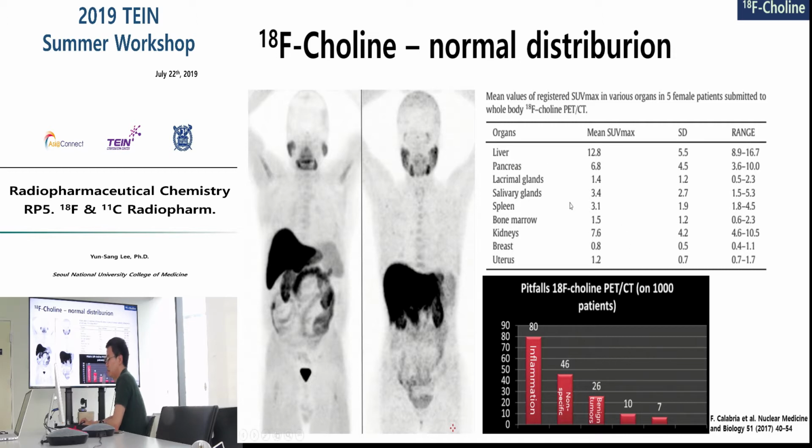And some pitfalls of choline PET are reported, and the most highly reported cases were about inflammation, followed by non-specific uptake or benign tumors.